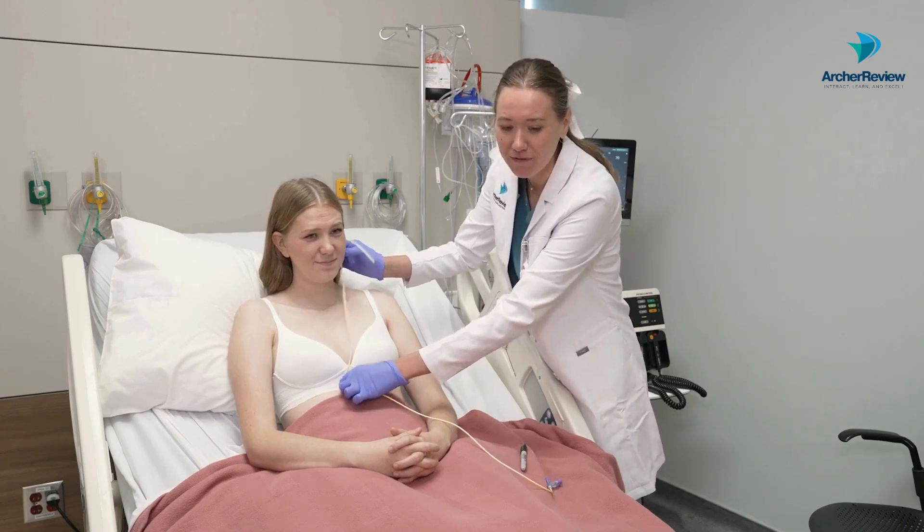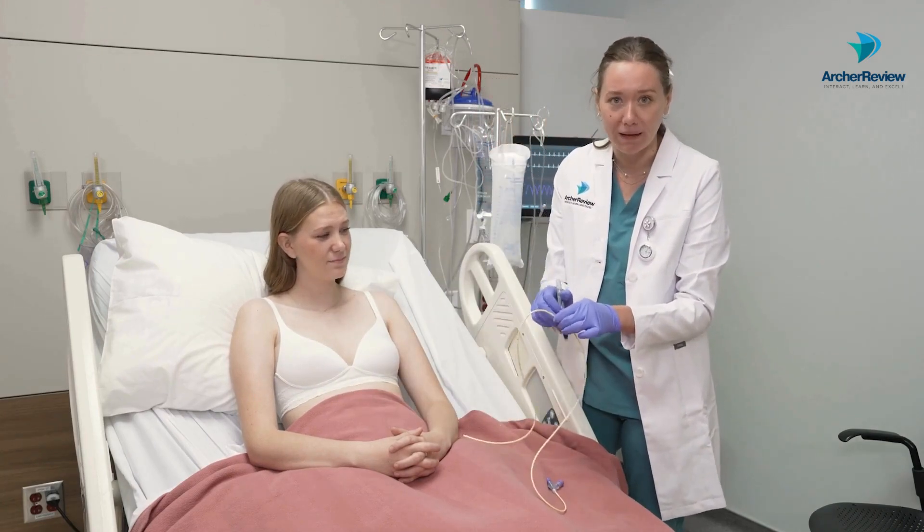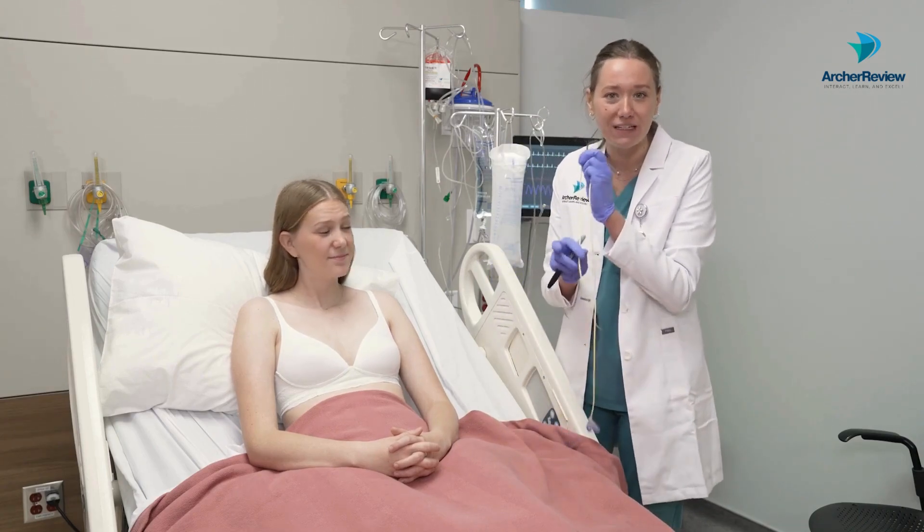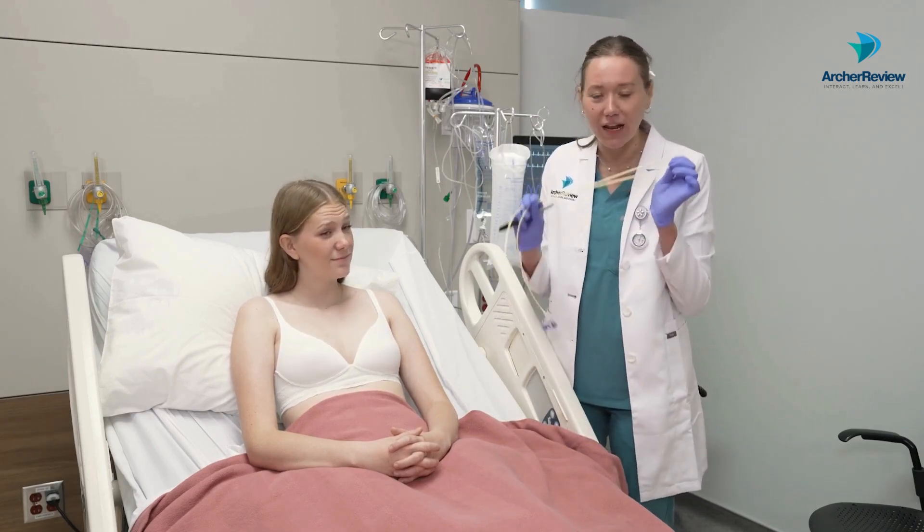Go ahead and grab it with your finger after you've marked it, then mark it with a sharpie so that once you let go and place it later, you know how deep you need to go. And that is how you measure an NG tube for placement.